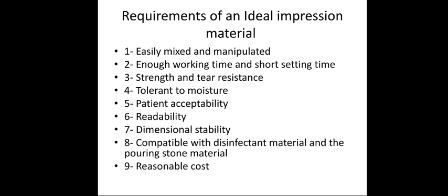It should be acceptable to the patient, should give clear details and readability. The manipulation and the mixing is easy. All these requirements, all these properties are required in the ideal impression material. Can be disinfected, and the cost also must be reasonable.